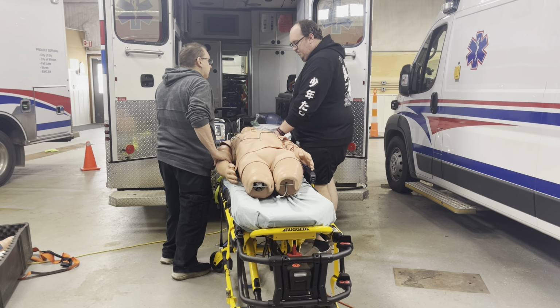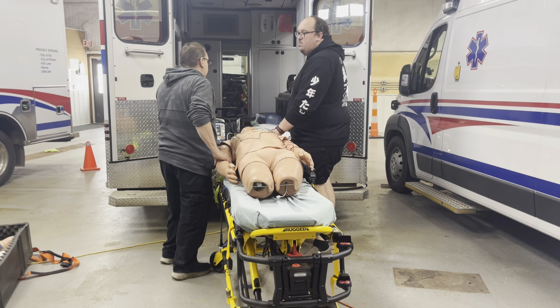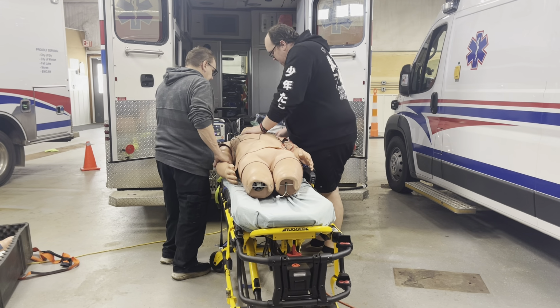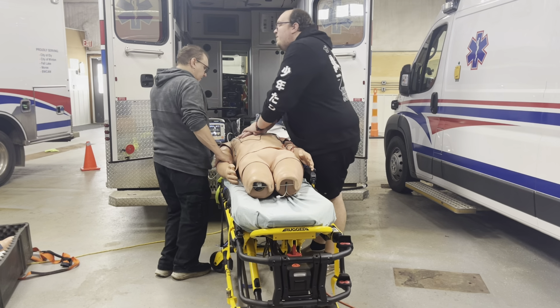Shock. But he has no pulse. Oh, CPR. Perfect. So we start CPR on him. And as we're doing CPR, how often do we check him?